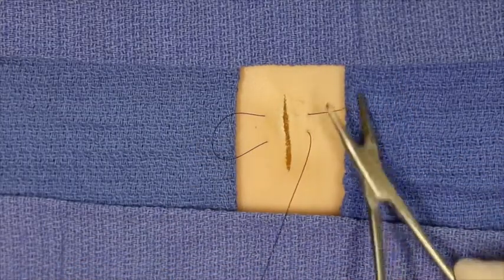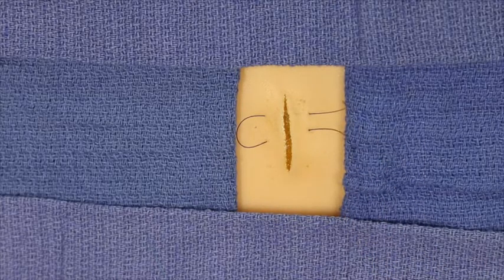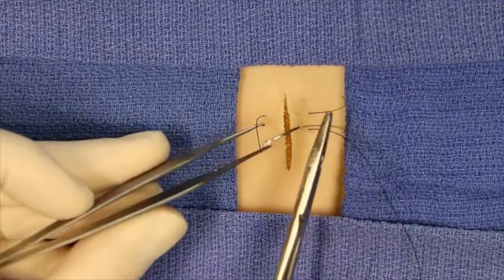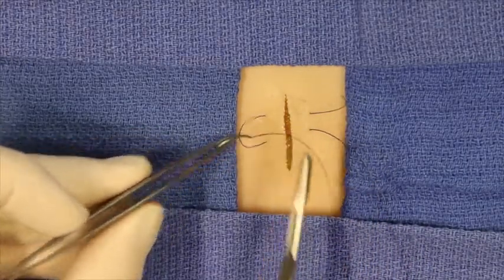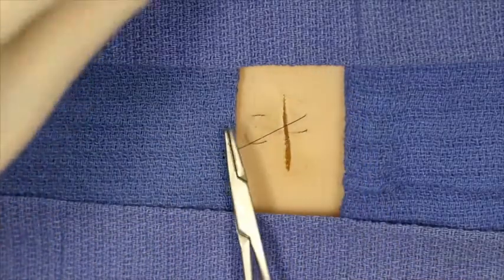In order to lock the suture there are two approaches that have been advocated. One is to simply take the needle, pass it under the loop, pull through, and then tie the suture.